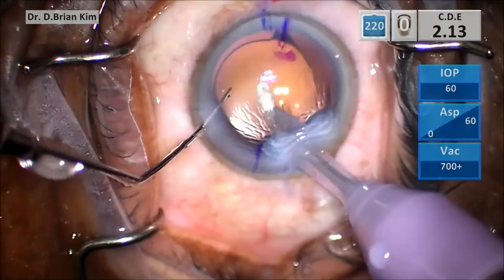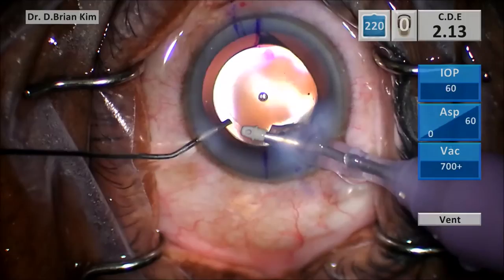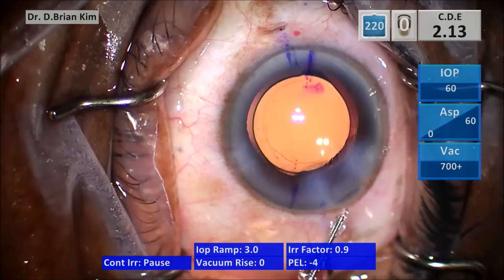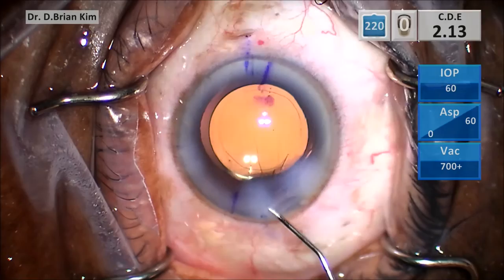The irrigation handpiece keeps the capsular bag taut. Another tip I like to share: I use my cannula to keep the anterior chamber stable so there's not much trampolining of the anterior chamber when I withdraw the I/A handpiece. I use my BSS cannula to keep that chamber nice and stable. As you can see, there is perfect alignment of the toric hashes along my corneal markings. This is my technique for toric IOL placement and positioning — thank you for your attention.